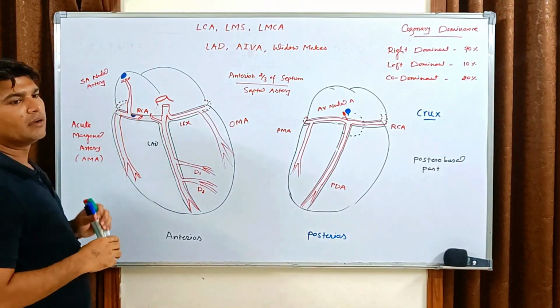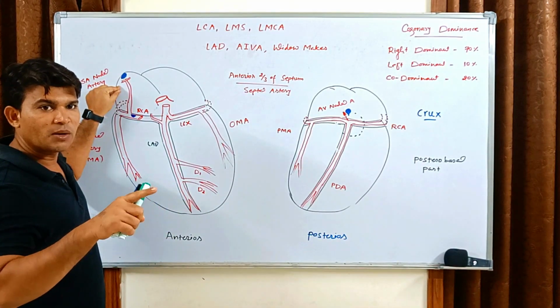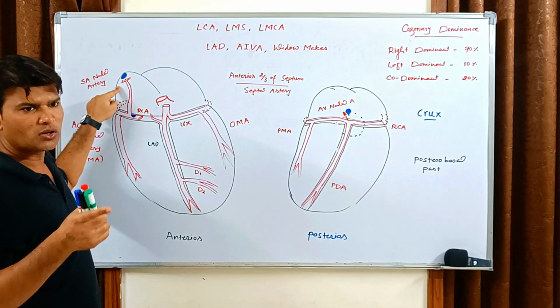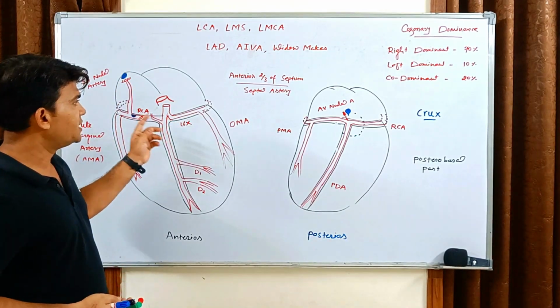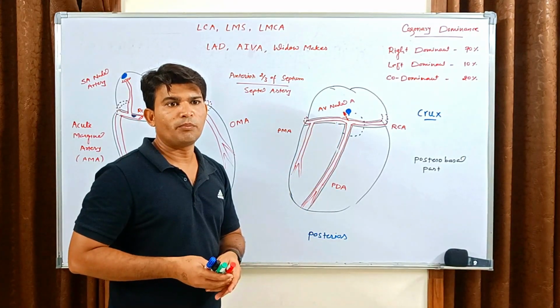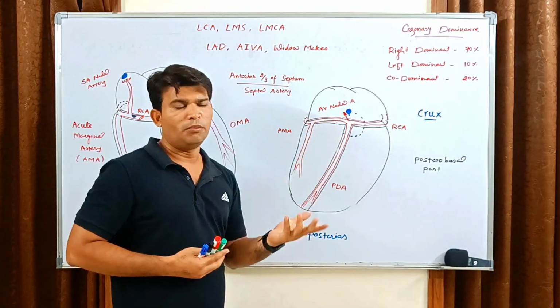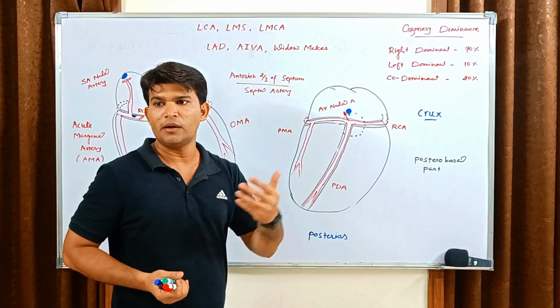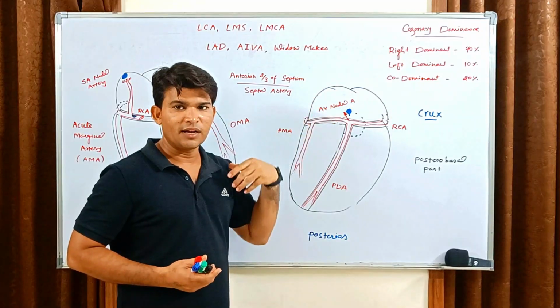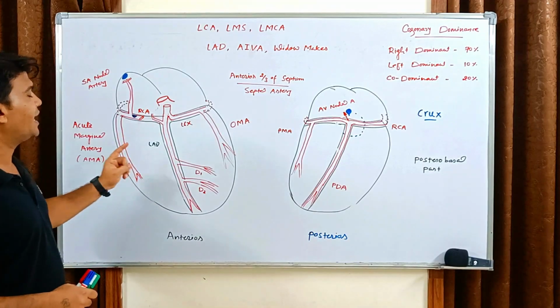So in that case, there is a high chance we will see sinus bradycardia in inferior wall MI and posterobasal MI. Yes, we can see sick sinus syndrome, sinus bradycardia, or nodal block. So the patient may present with the classical symptoms of MI with heart block, maybe first degree, second degree, or third degree, depending upon the injury to the AV node, and even sinus bradycardia. Am I making sense or not? Very good, right? So this is a classical sign.